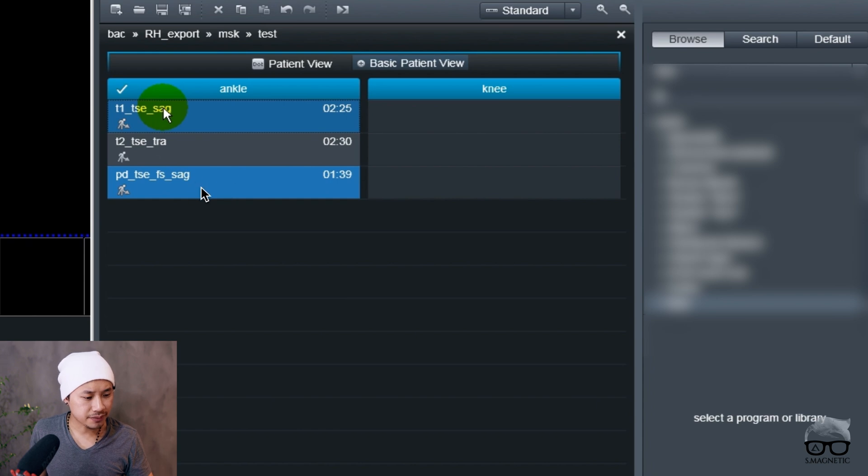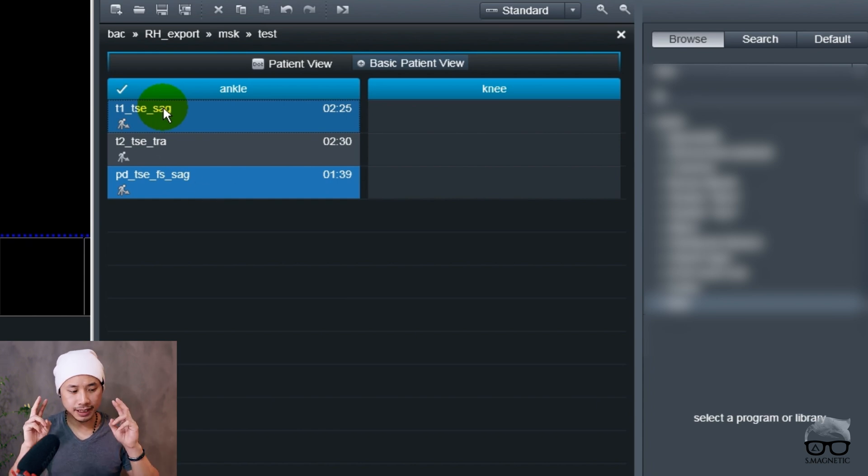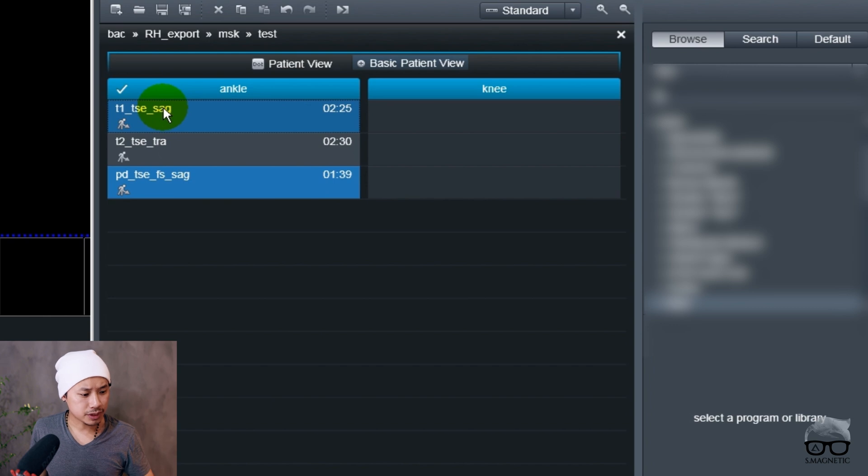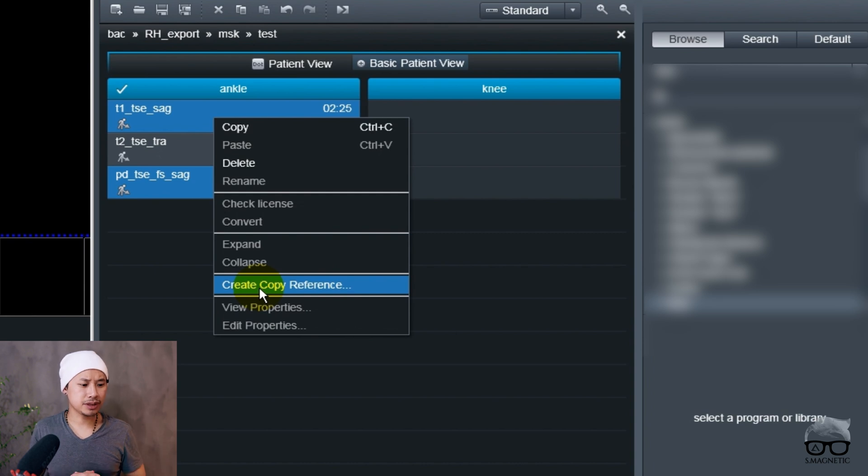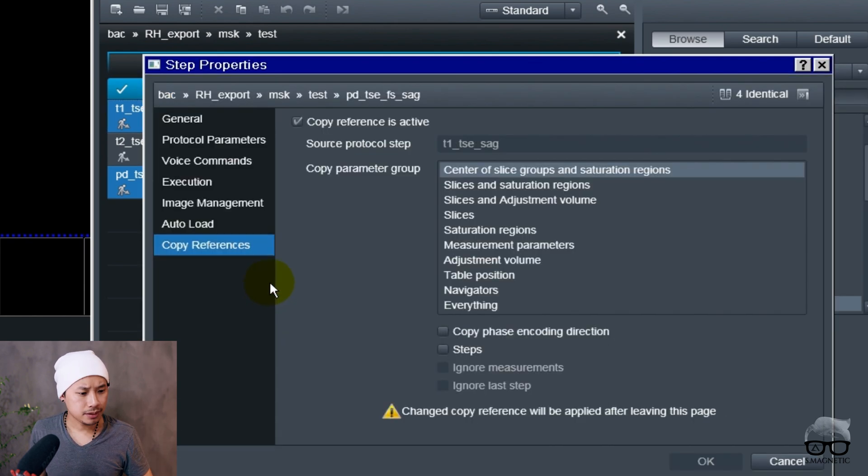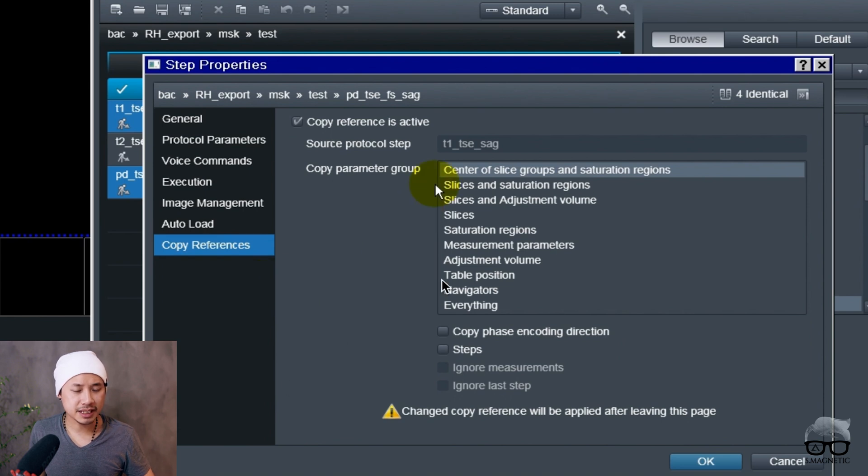What you're going to do now - since this sagittal is for the foot ankle and the sagittal PD fat sat down here is for the knee - we mark these two sequences. Then we right-click and we use Create Copy Reference. In here you have something called center of slice groups and saturation regions. We put OK on that.